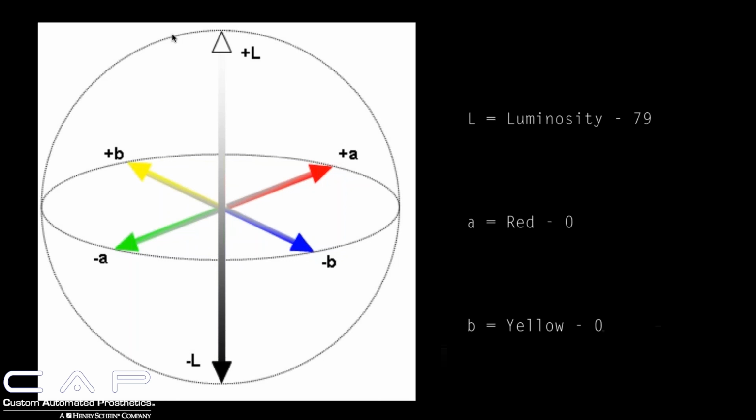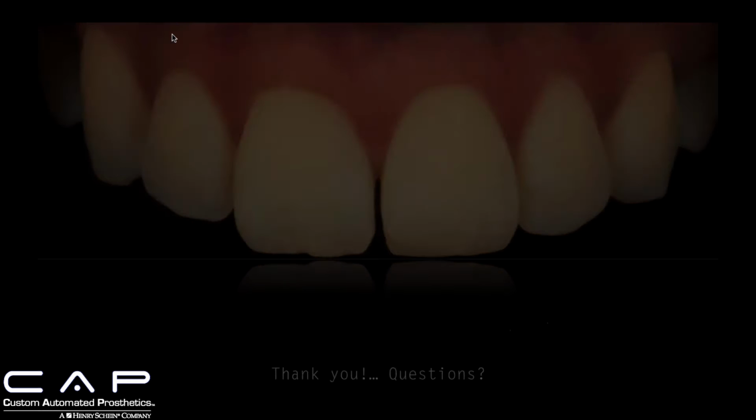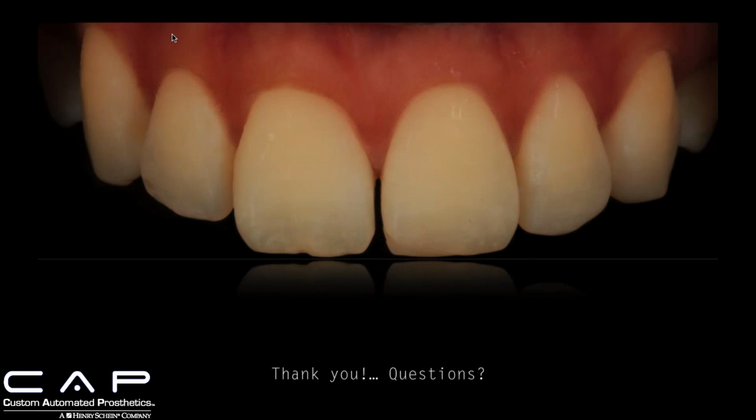Okay, so this is a little diagram here to show what the LAB stands for. B being the yellow, A red, and then L is the luminosity. There are some really great YouTube videos on this. If you just Google Sasha Hine eLabor aid, it will come up, and he walks through it and makes it very, very clear and very, very easy. So check that out. This is the final photo.